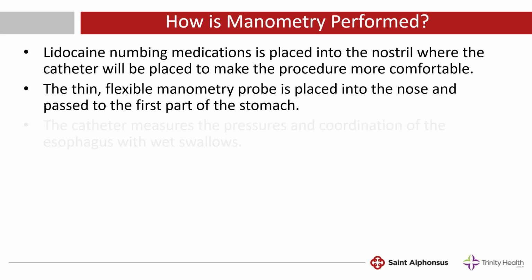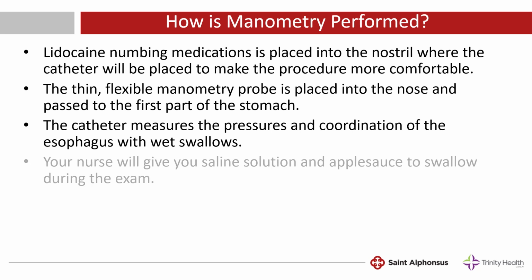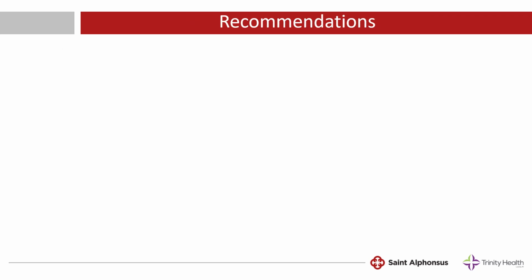This catheter measures the pressures and coordination of the esophagus with wet swallows. Your nurse will give you a saline solution and applesauce to swallow during the exam. The procedure takes about 20 to 30 minutes. It's okay if you drive yourself to and from the procedure.